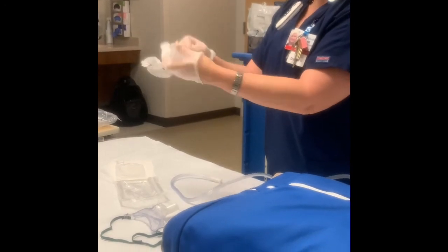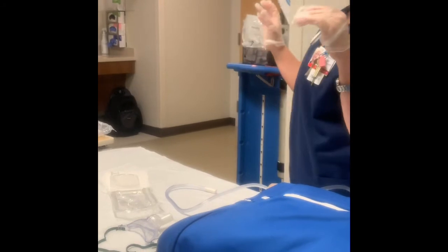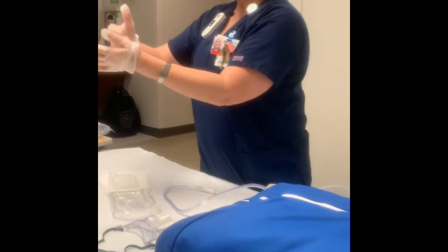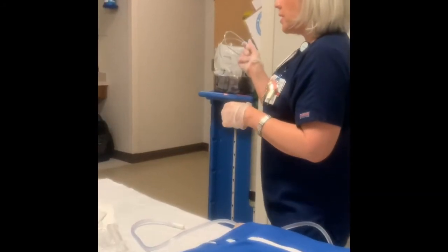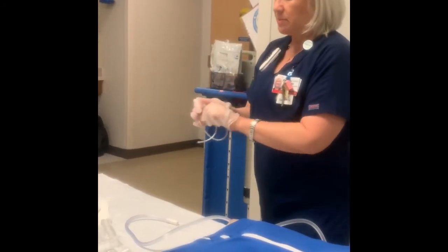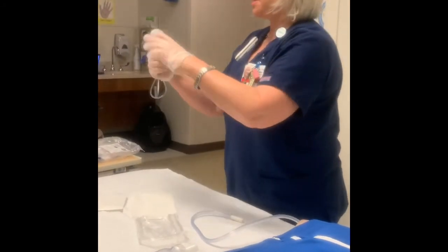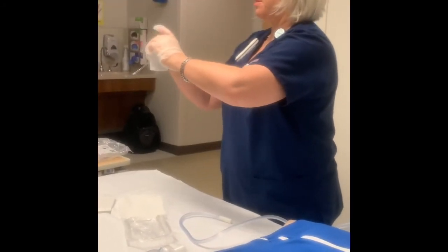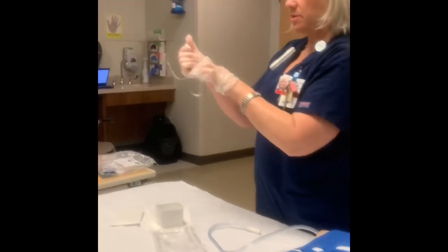And you can suction them as often as you want. There isn't any policy that reads that you can only suction them so X number of times. You can suction them anytime you want. So you have your suction catheter. It doesn't need to be lubricated. Do not lubricate it. I've seen people do that before. You also have in here this little container, put sterile saline in there so you can clean out your tubing here.